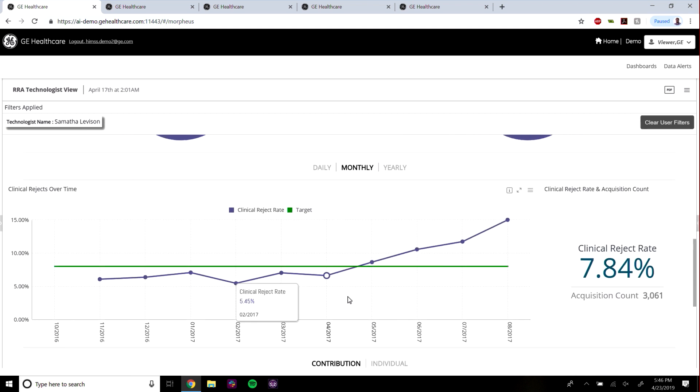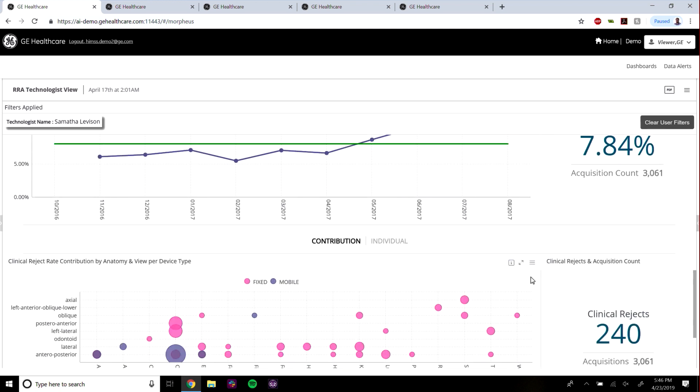Here we can see over time how Samantha's reject rate trend has been climbing even though her overall average is below the target.